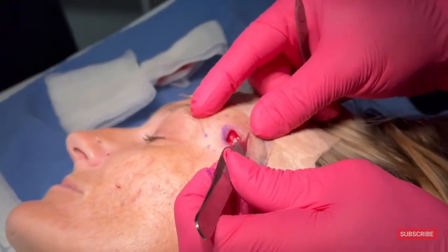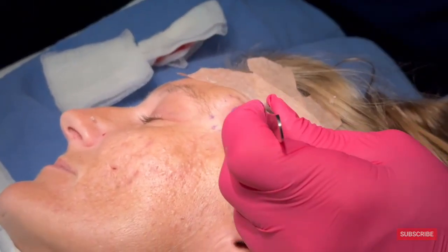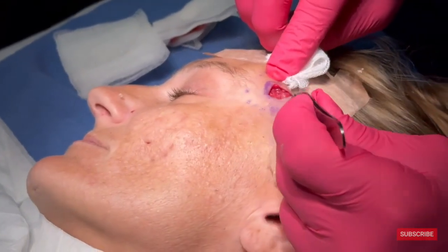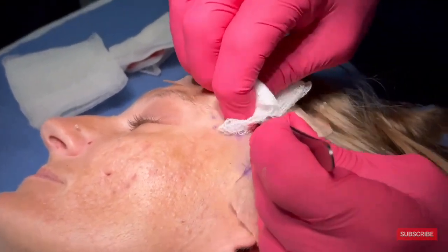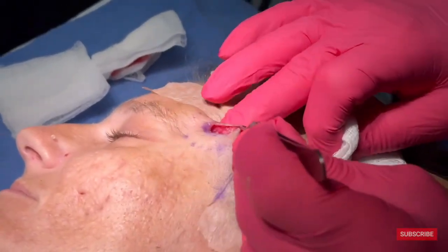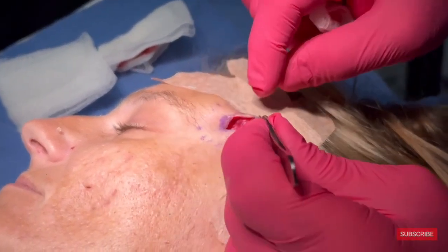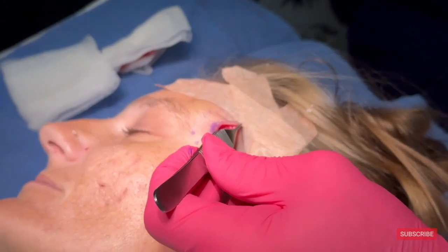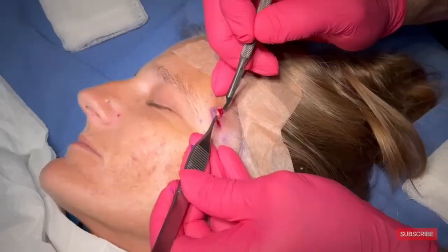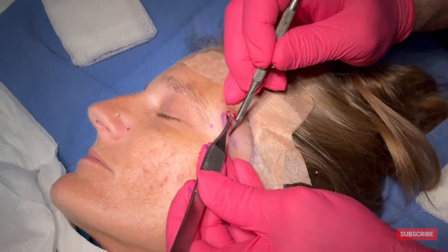Most people would be scared to do a cyst here because of this temporal branch, right? So why are we not scared? Because if you see, there's no injury. It's original layering of the skin. So whatever she had before, that's what she has now. I'm going to now make it pretty. Which boundary? Exactly the one I drew.